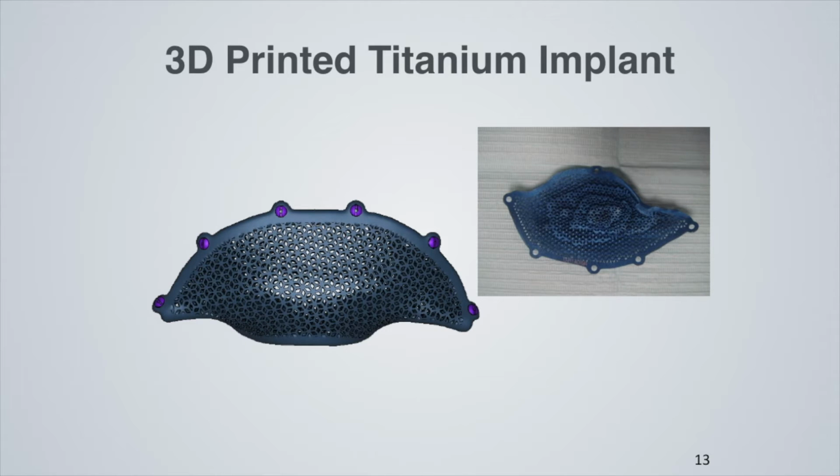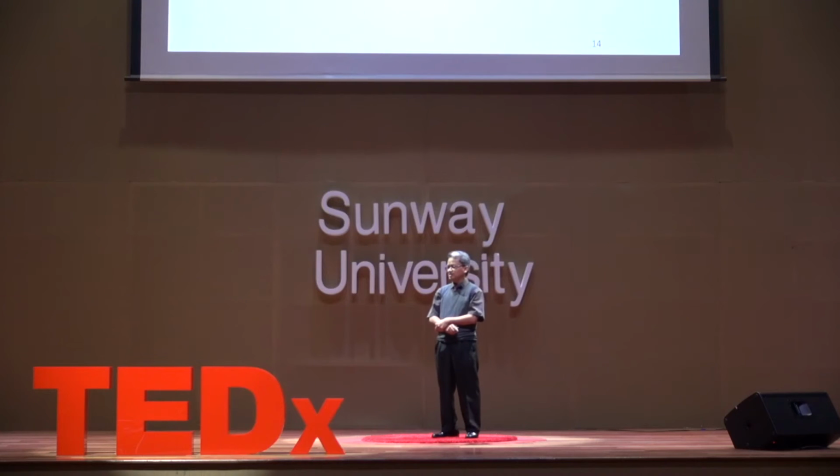So we revised the plan, and this is the extreme end of 3D printing in the medical and surgical industry, in which we can print implantable material. It is a customized treatment for patients, and this is how it looked when it was delivered to me. I like the scaffolding underneath because of the strength, which is very close to the surrounding strong bone. This was during the surgery. It snugly fit into the surgical area, and we finished this in slightly less than 2 hours. She was home after about 5 days of hospitalization.